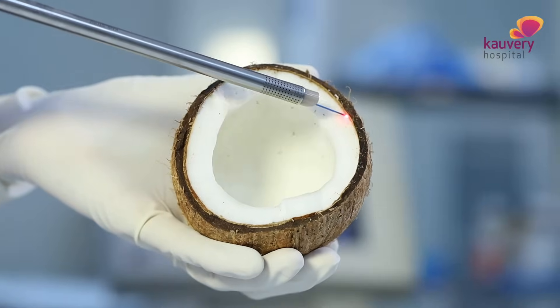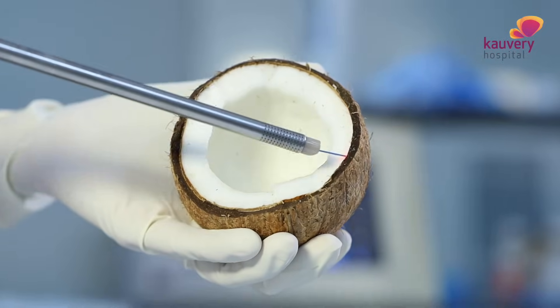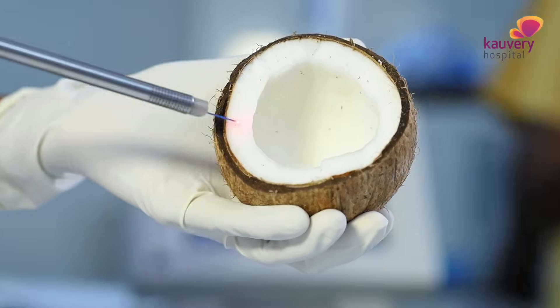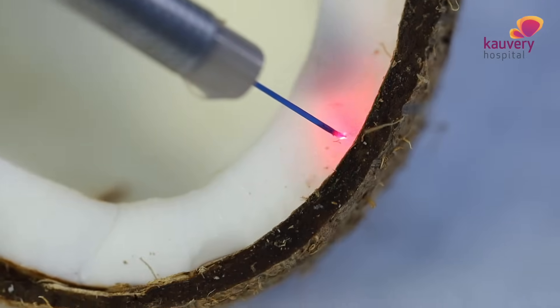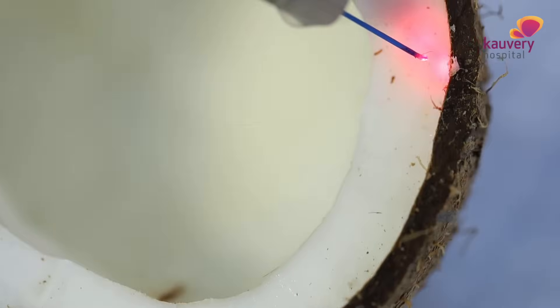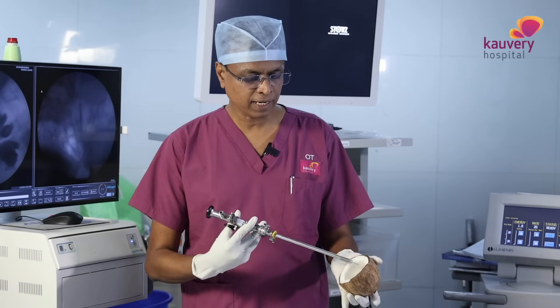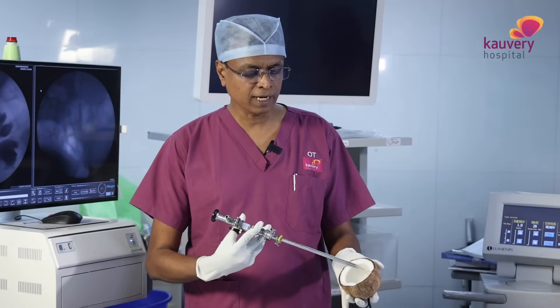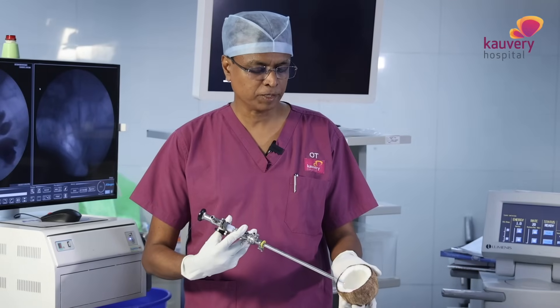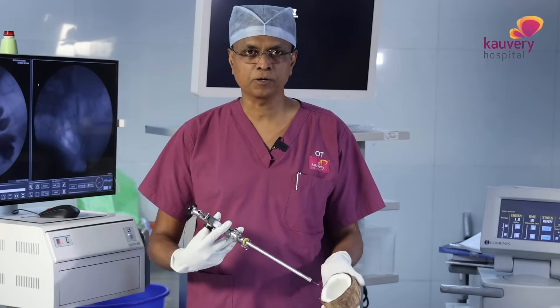When you use the laser, you work precisely at the capsule level. If you maintain careful dissection at the capsule level, you will achieve full control and complete the enucleation process. If the capsule is fully cleaned, the recurrence rate will be greatly reduced, and the patient will continue to have a perfect urinary flow.